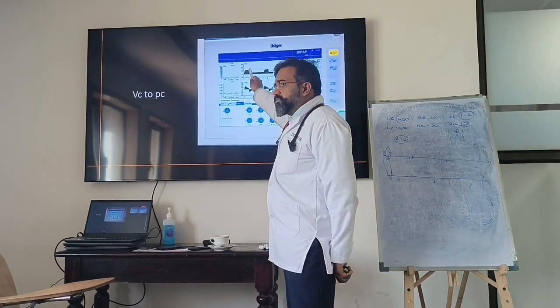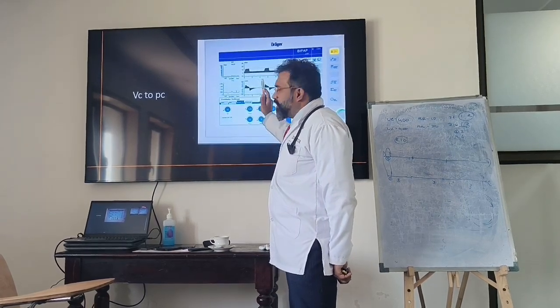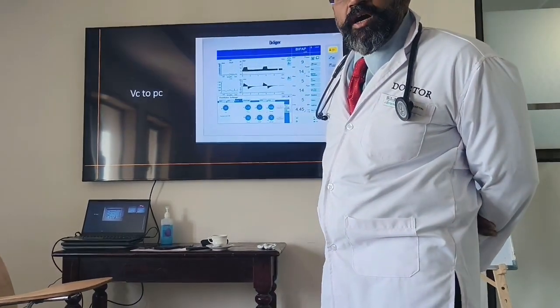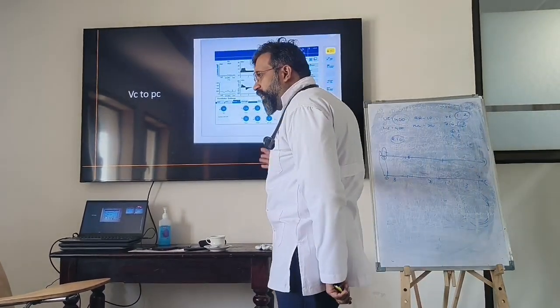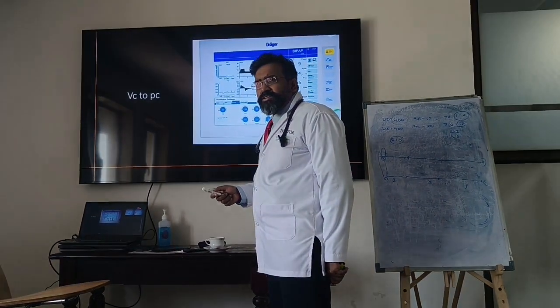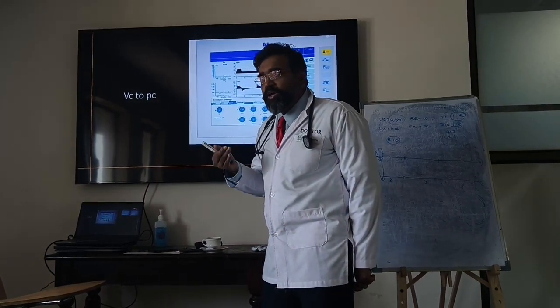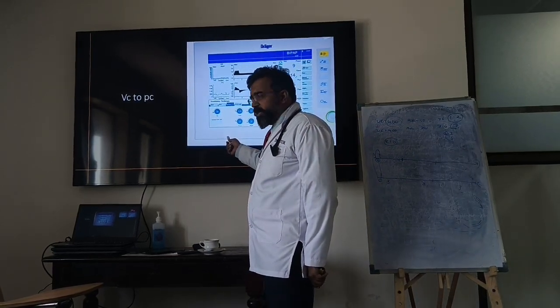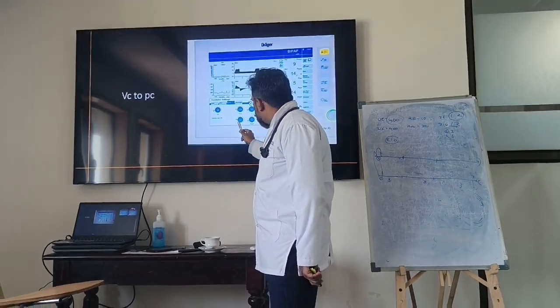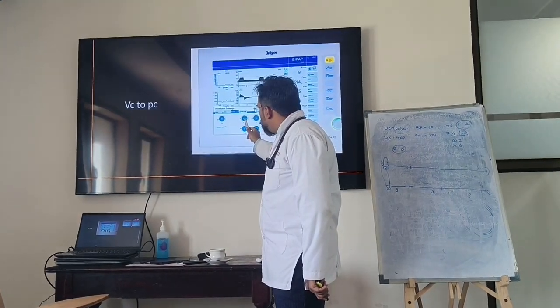Pressures have become limited. A decelerating wave flow pattern has started, and cycling has changed to time cycle. Clear? So on this ventilator, pressure control is called BiPAP. The same pressure control we just talked about in our graphics analysis is called BiPAP here, because I have set my frequency, my pressures, my peak, and my inspiratory time. This is determining my I ratio.